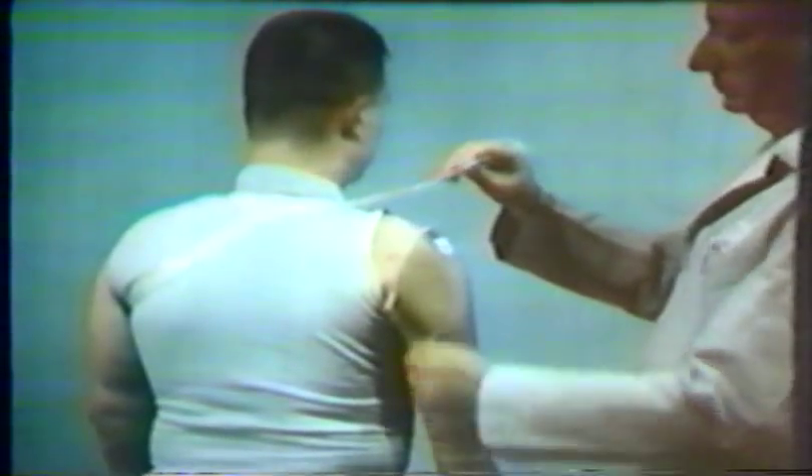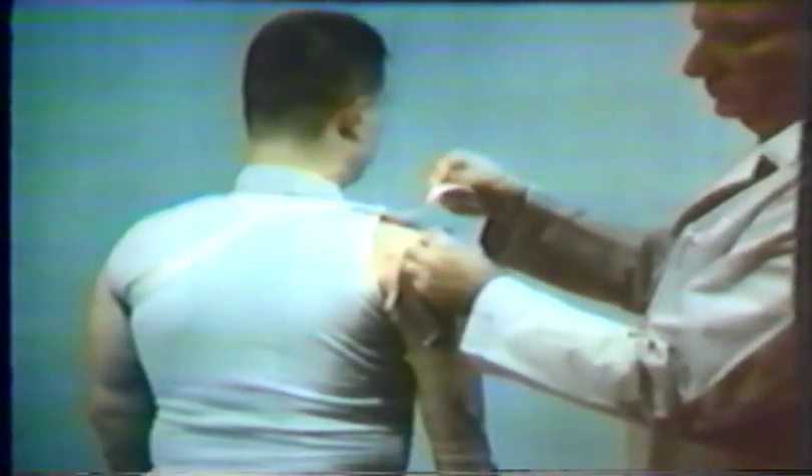The third element of the harness is called the lateral suspensor. The lateral suspensor passes just anterior to the acromion process, and is attached to the proximal part of the humeral section of the socket. This strap is the main suspensory element of the harness.